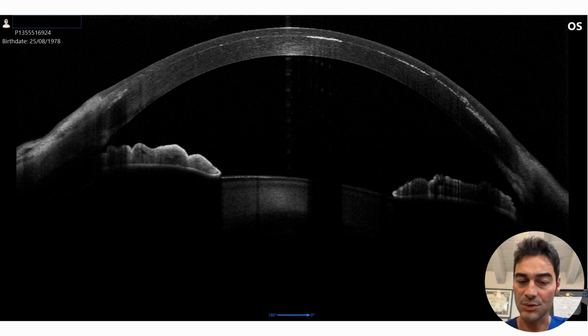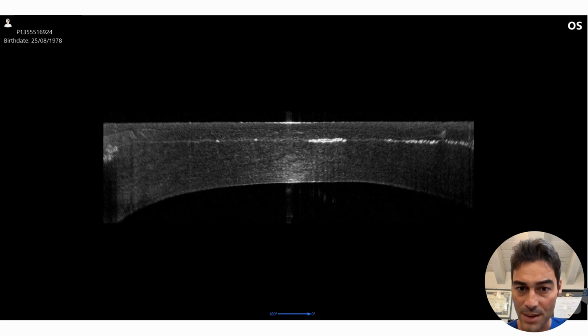And thanks to the anamorphic display, the applanation-like display, we could double check that the new plane, as you can see, is well below the previous plane. So we didn't intersect the previous interface and we were confident to go ahead with the new flap.